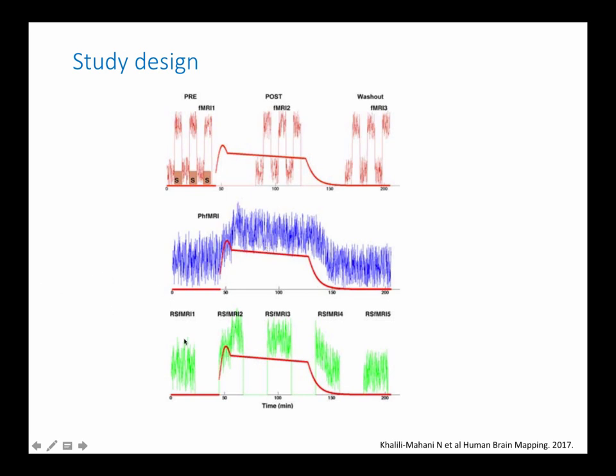And usually what happens is you can't actually image during the whole thing. You might have things like IRB requirements of making sure the person's blood pressure and heart rate and so on haven't changed while you're giving it, so you might have to break up your imaging periods into several different shorter time periods.